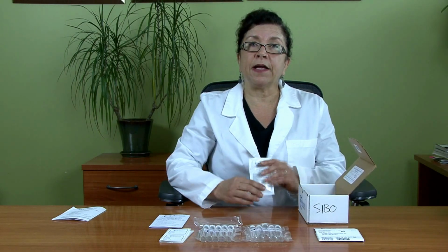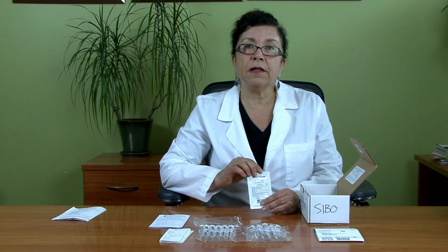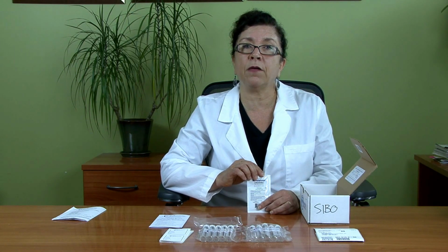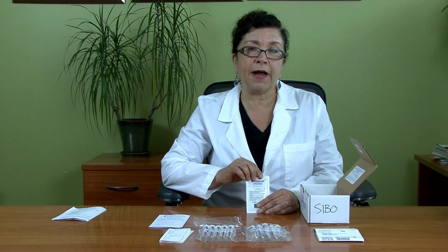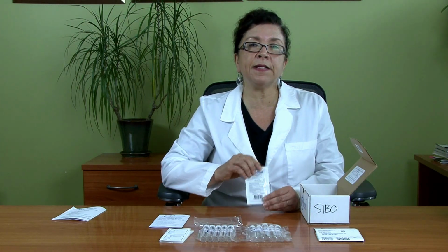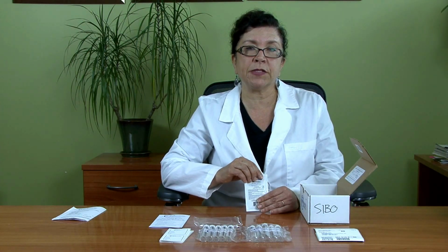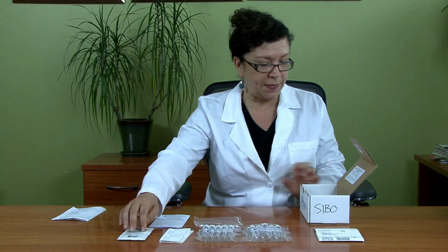We have the Lactulose powder that you'll be drinking in 4 ounces of water. Lactulose is a synthetic sugar, so this is not related to dairy, so don't worry if you have a lactose intolerance or a dairy allergy. Lactulose is synthetic, and it is an indigestible sugar, and it helps us determine whether you have bacteria in your small intestine. So let's go ahead and set that down.